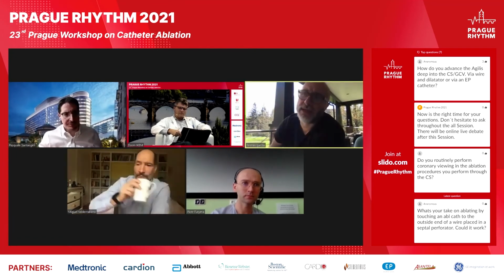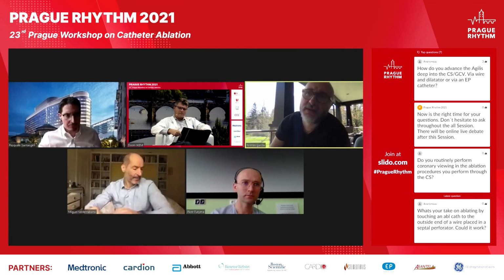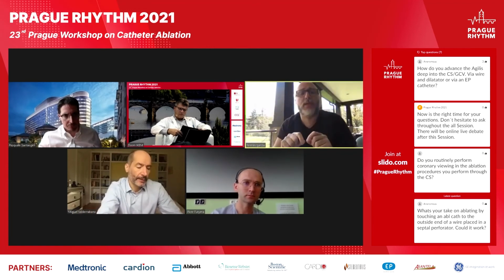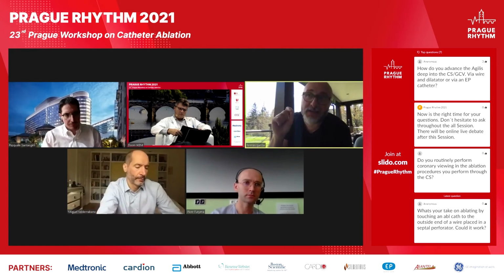Yeah, so we basically just use the Agilis itself with the wire that comes in the Agilis. You don't need a dilator. You don't need anything stiff. You just clock and then clock again. And then the reason we use Agilis is not because of the steerability, it's because of the size. So you can put more than one catheter. For example, if you want double map, you can put a 4 French and a 3 French, or if you want to do more mapping, it's because you can advance more than one catheter. And that's why we use Agilis.